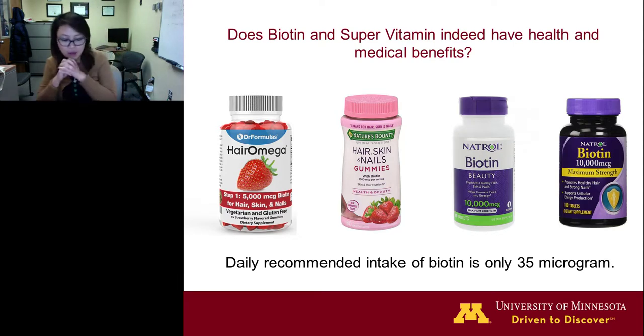I think from what I've talked about before, we have now seen a trend of biotin use, and the trend is increasing. About 7% of the people presenting to the ED use biotin, and about 7% of the samples assayed in the ED could have biotin interference that changes the lab results. So this may have some impact on the diagnostic industry.